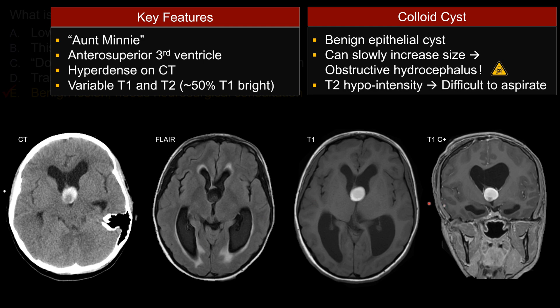The degree of T2 hypointensity — the so-called motor oil consistency — can dictate how easily the lesion can be aspirated. So the appearance on T2-weighted sequences may determine which surgical approach the surgeon wants to take. It should not enhance. On T1 post-contrast, you may see a very thin rim enhancement, but centrally you should not see any enhancement. This is a cyst, not a neoplasm.